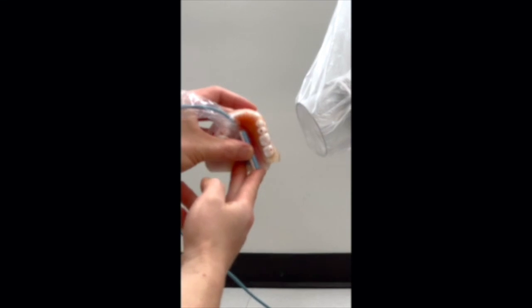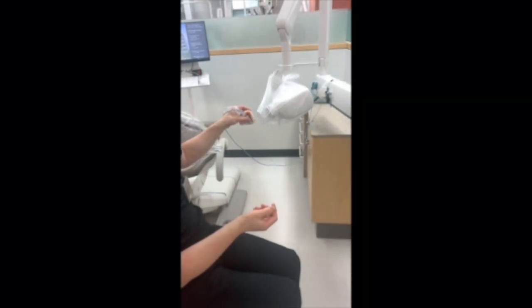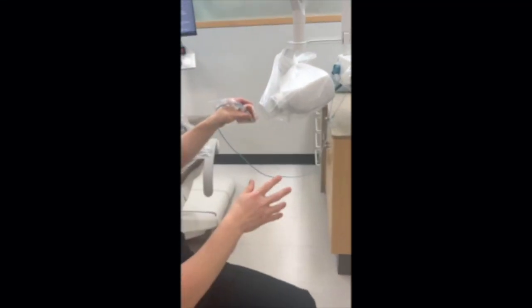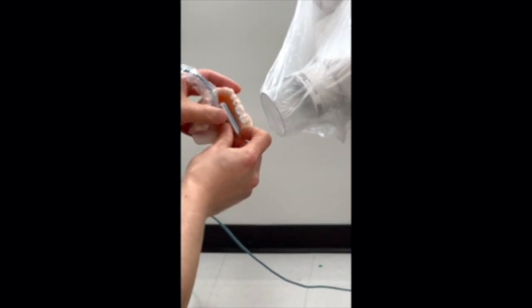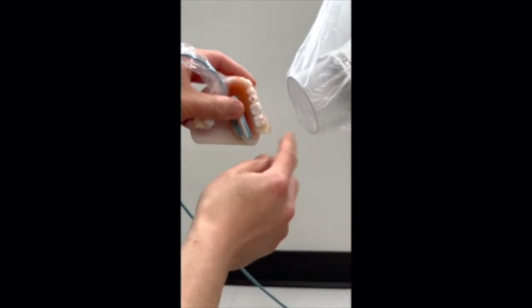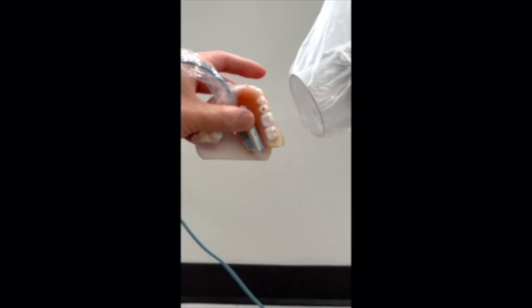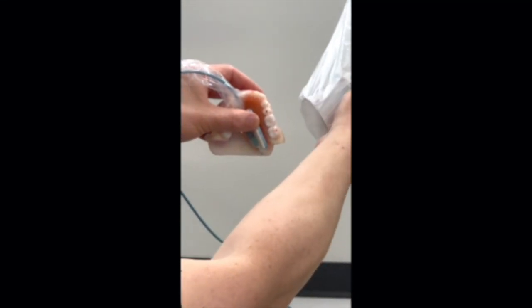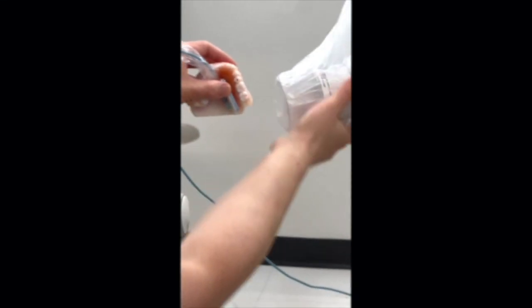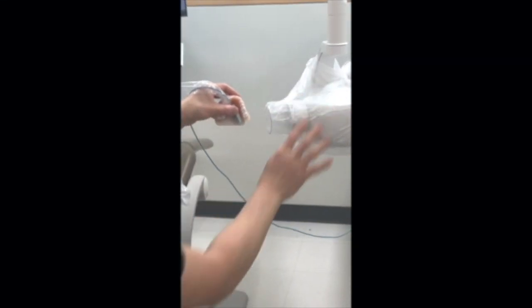So when you take this radiograph and you have the mesiolingual, then you have to instruct the patient to continue holding the sensor. We need to take one more radiograph and have the patient continue to hold it in the same location. Then you need to shift the X-ray tube a little more distal or a little more mesial, whichever way was the opposite from prior.